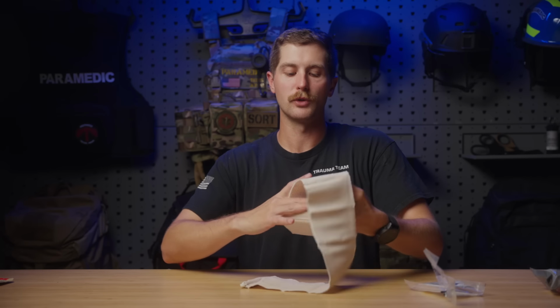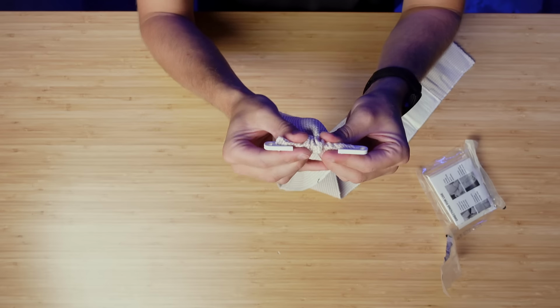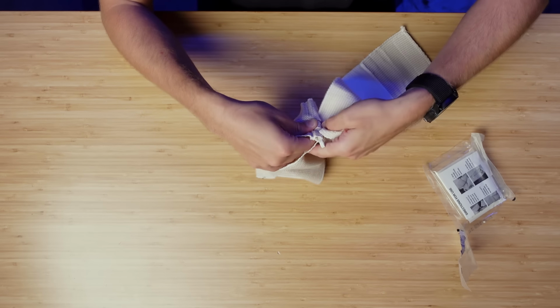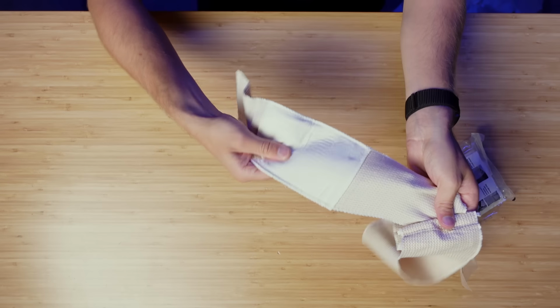This Velcro is going to adhere. And then as I come around, I can use this hook, which is the same as what's on the North American Rescue bandage, one side and the other, it's going to hold tight. You have the absorbent pad in the middle to just put that pressure down and hopefully keep the wound from getting too messy and getting stuff on you.